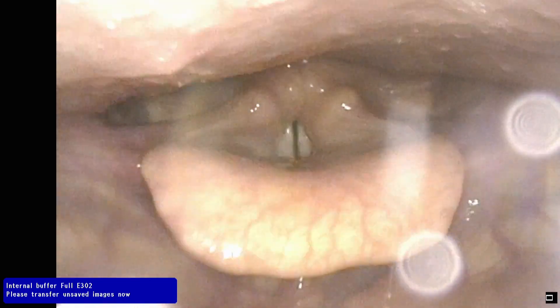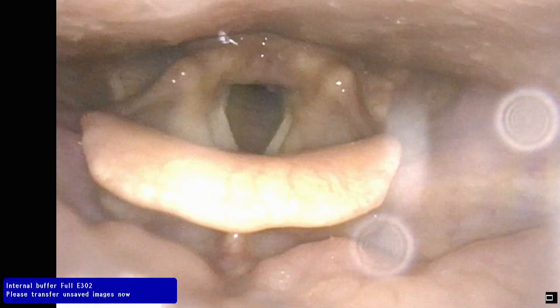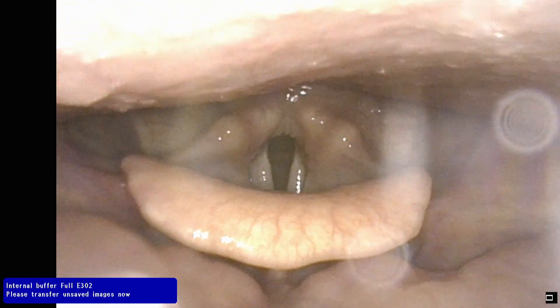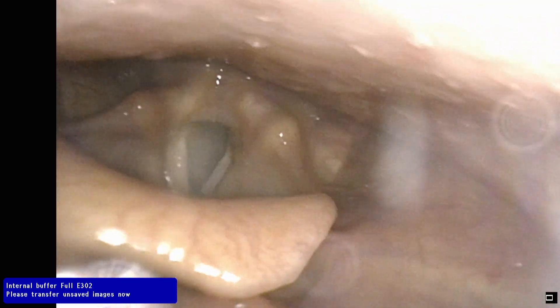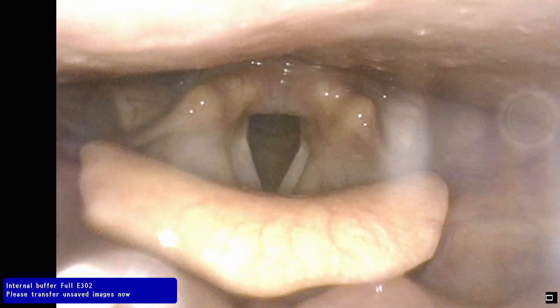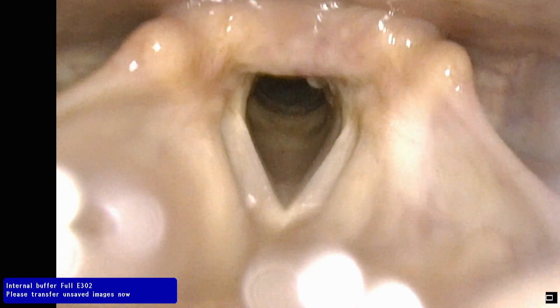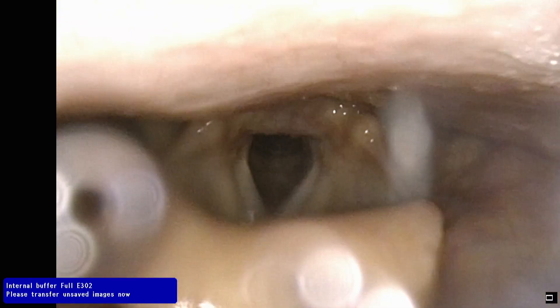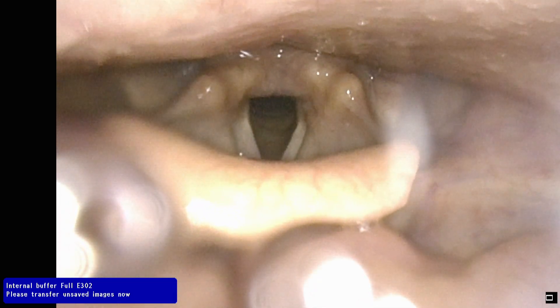Okay, can you see okay, Heather? Yeah. So the big curvy thing right here, that's your epiglottis — it covers your airway when you swallow. And then this bumpy thing here is your tongue. And then this back wall thing, that's your pharynx that I was talking about. And then down here, if you just focus on your breathing for a second, those are your vocal cords. They look good — the color is very nice. They're white, not red or super veiny or anything like that. So that's awesome news.